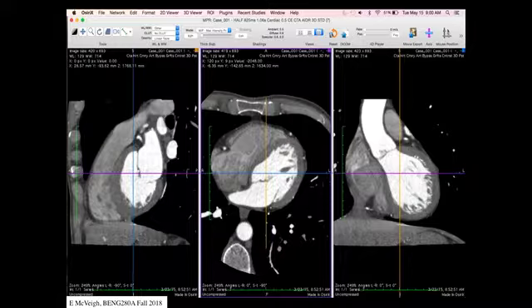So here, if we look at the three-dimensional data through a patient's chest, these are CT images. This is called an axial plane through the patient's chest. An axial is if I'm lying on the table and I take a vertical plane and chop down that way, that's through here. So the chest wall is up here. This is the sternum. This is the heart. The spine is down here. These are lungs. Okay? And you see very bright signal here. That's the blood inside the left ventricular chamber, and this is immediately after the injection of that contrast agent, perhaps 10 heartbeats after the injection because it has to go through the lungs and come back and get into the heart. So you time that.